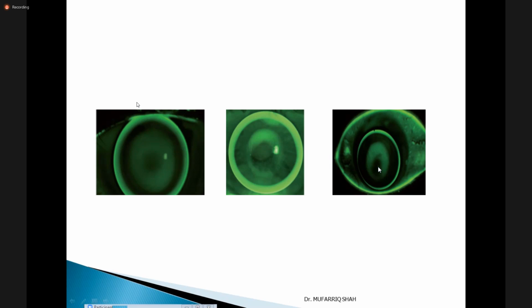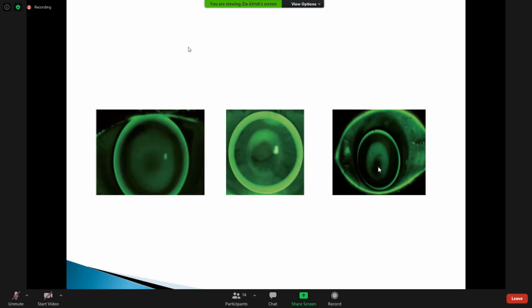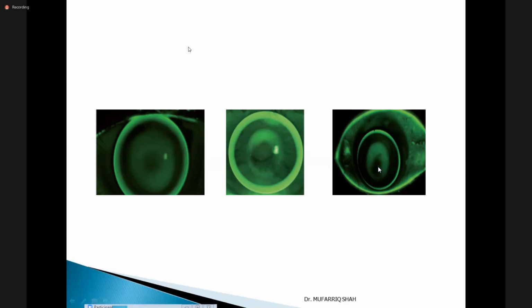We should increase the dia. You may need to increase the dia, right? So in this case, you must be careful. Suppose you see this case and this lens, you say yes, this is okay, otherwise central is good, but I will order a bit loose periphery.